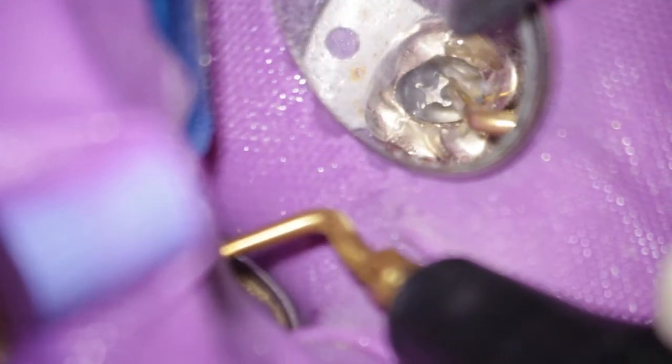Now we have water cooling. You can see how the post vibrates. That will destroy the connection between the post threads and the dentinal walls. With time the post will lose its friction, but it also takes time and patience. Always with water cooling.